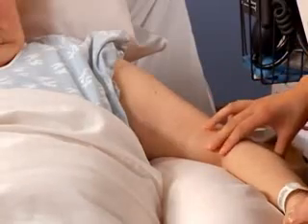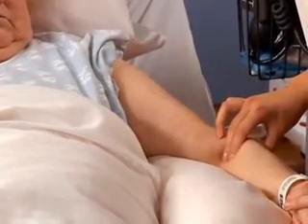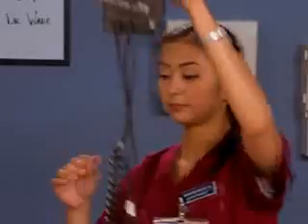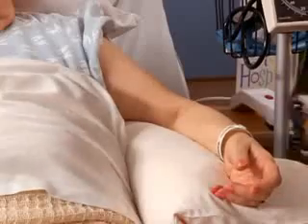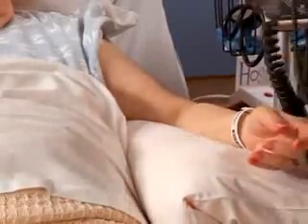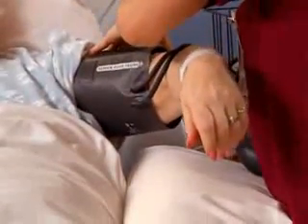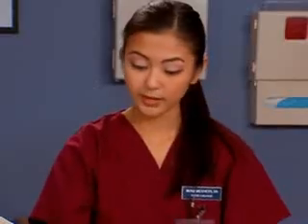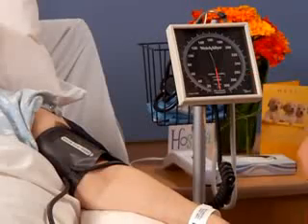You'll want to palpate the location of the brachial artery. Right. Okay. I'll put the center of the cuff about midway on the arm, so the lower edge is about 1 to 2 inches above the inner aspect of the elbow. And I'll line up the artery marking on the cuff with the brachial artery. Right. Okay, and let's see. The needle is within the 0 mark.